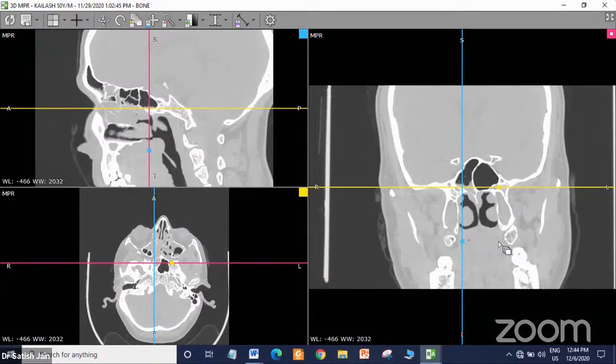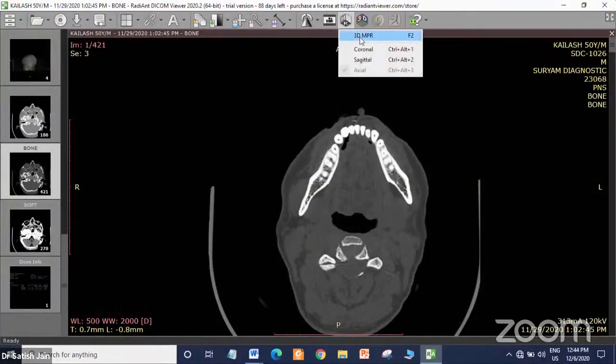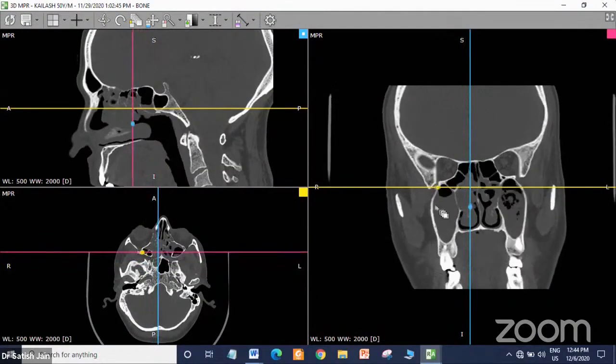So it is practically impossible to carry, for the patient, all those printouts for 2500 slices. So it is not required as well; simply have the data on the DVD, only axial, and then your software will reconstruct everything. And more than this, you will get a DICOM software. You will get dynamic detail in all planes. See that? This is DICOM software.